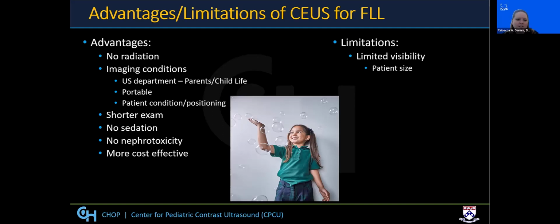For limitations, you can have limited visibility with patient size. So larger patients, just like in adults, you can have limited visibility. And it's also operator dependent, and it requires not only the sonographer to have training and education, but also the interpreting radiologist.